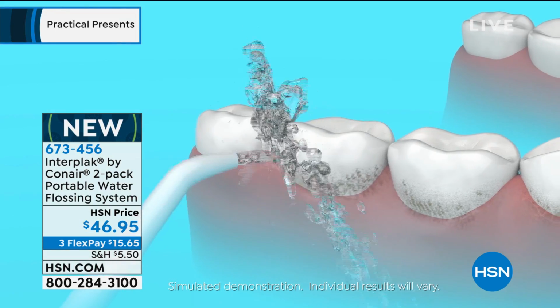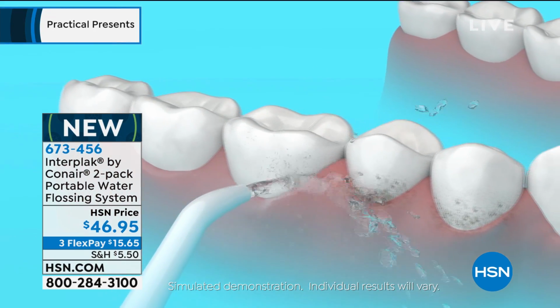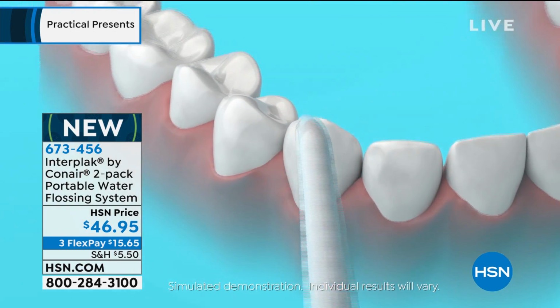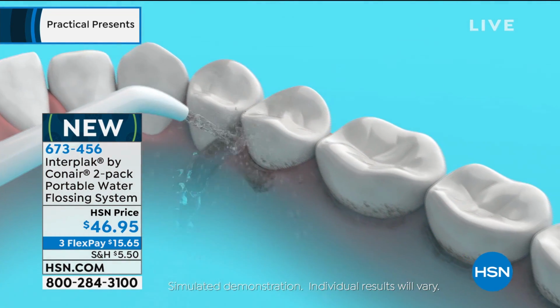and then do the entire flossing of your mouth. It actually goes in and it massages the gum lines, but what it does is it gets the stuff that is below the gum line, not just in between the teeth. You can see how it kind of vibrates and sort of pulls that out a little bit at the gum line and gets underneath there. Traditional floss doesn't get under those areas.